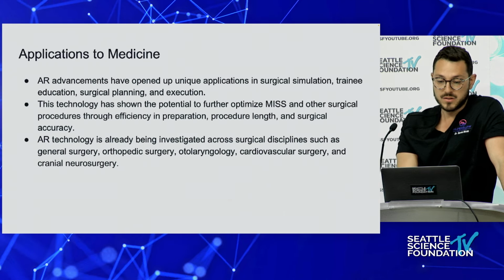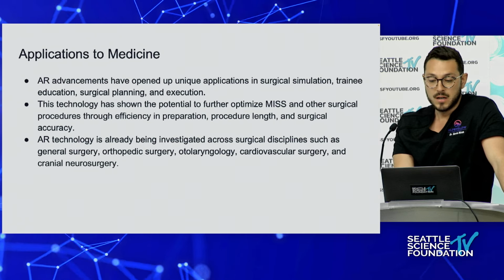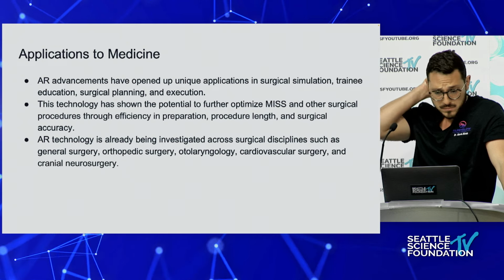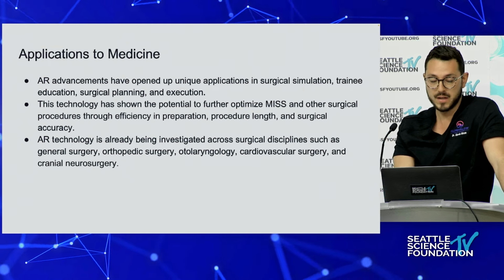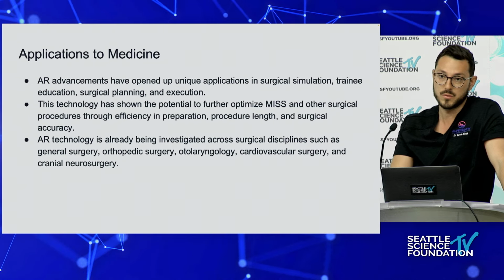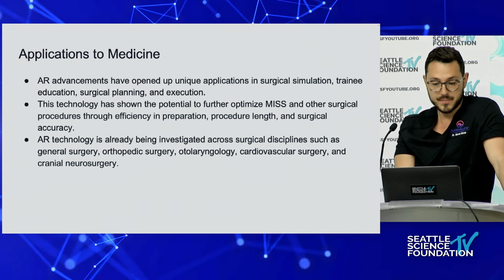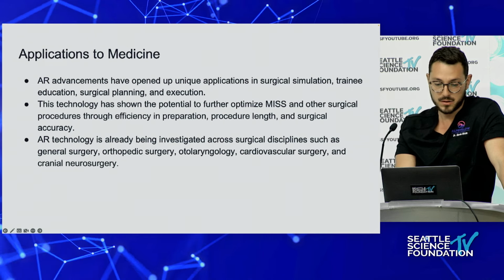The real applications overall for us are mainly around the navigation component, but this is also being deployed for a lot of physician training. I don't know if you've heard of Med-Ed Combine, which is an interventional pain program. They do a lot of training virtually through augmented reality as well, so you can walk through the workflow of a procedure, first looking at it with a headset on. So it's being developed. This is a new way to look at the anatomy and learn anatomy as well.